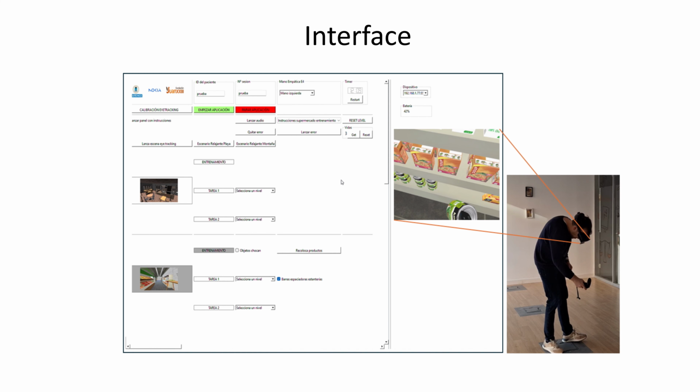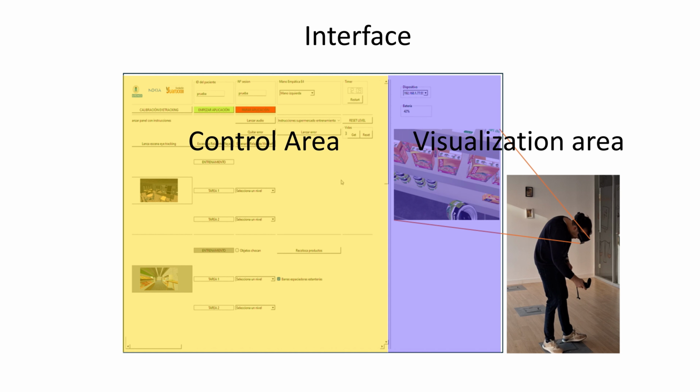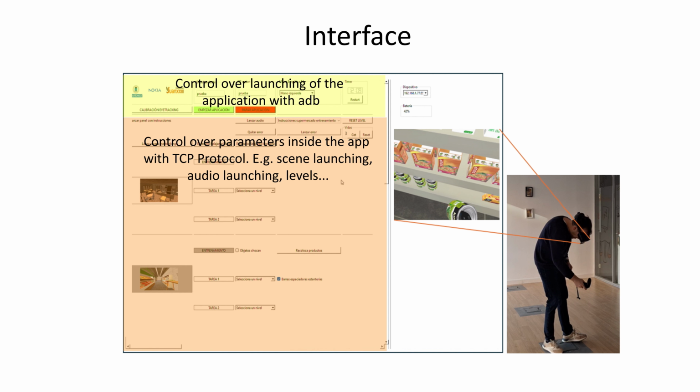This image shows the interface for the therapist to control the session. It is composed of a control area and a visualization area. In the control area, the therapist has control over the launch and stop of the application. The system also manages what the user sees and hears during the session. It controls the launching of the different scenarios as well as specific elements within those scenarios. Additionally, it is able to launch audio tracks.